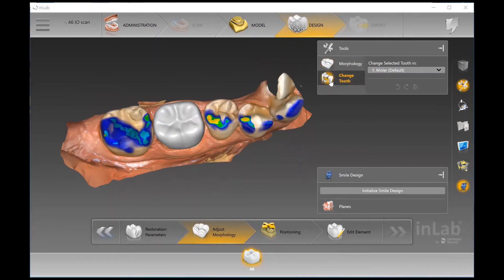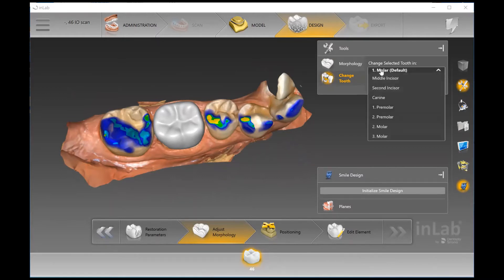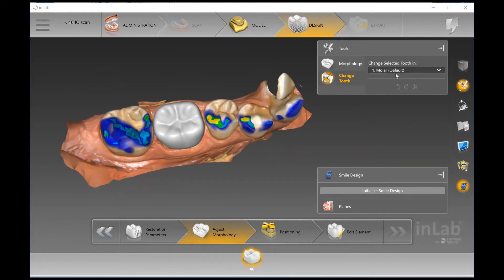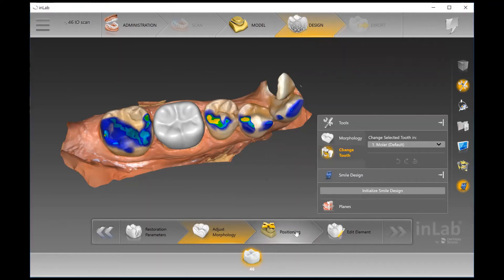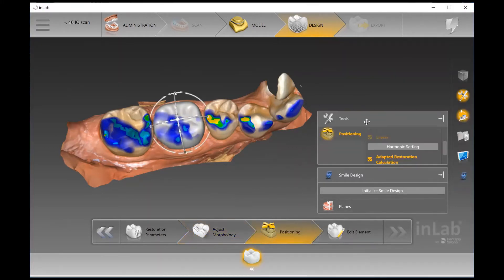The Change Tooth option comes in really handy if you're doing any pontic work. For example, if the pontic doesn't have space for a molar, not a problem — you can tell the software this is a 4.6 but we want it to look like a premolar. That comes in handy when space is a concern, allowing you to design based on the actual space allotted for that particular case.